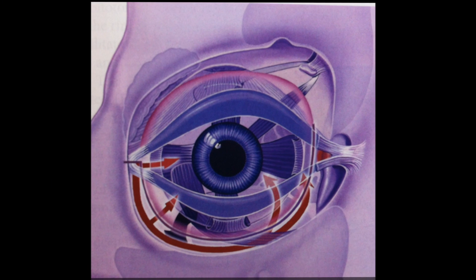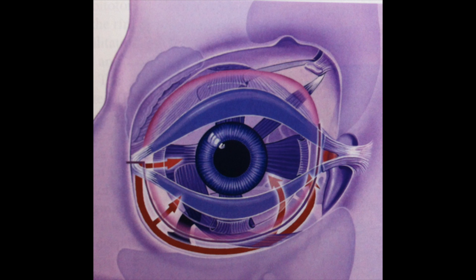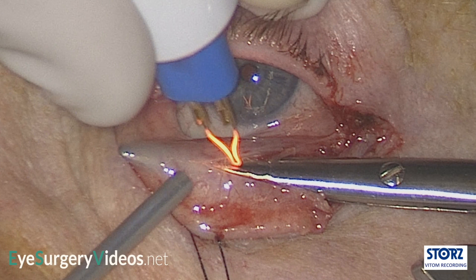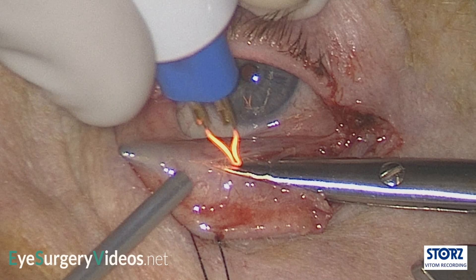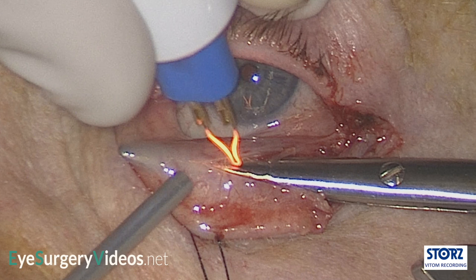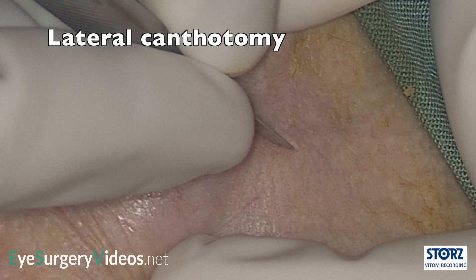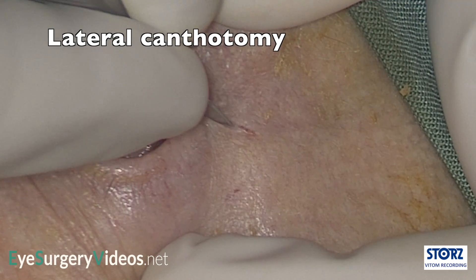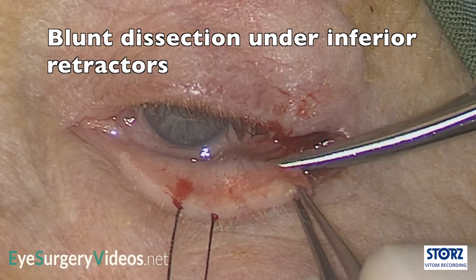The swinging lower lid approach gives excellent access to the inferior and lateral orbit as well as the orbital walls. This approach is conjunctival with an associated canthotomy and cantholysis. A small canthotomy is made, with straight scissors then passed immediately posterior to the retractors in order to create a pocket.